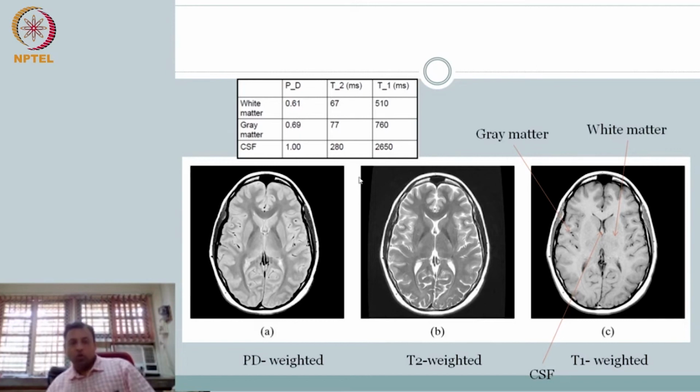So now you know, or at least you guess, that the white and black in each of these and the gray in between has to be related to, or weighted, more correctly to use the language, it is weighted towards one of the properties. So here the black, white and gray are all weighted based on the proton density parameter of the tissue. Here is likewise T2 weighted, here is T1 weighted.